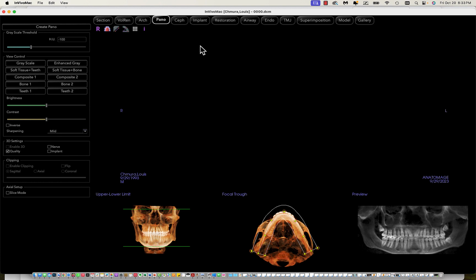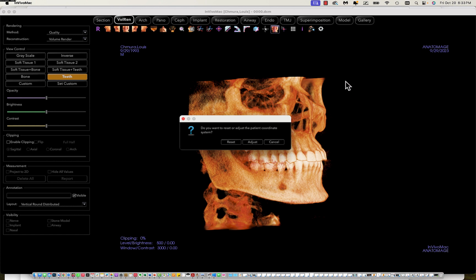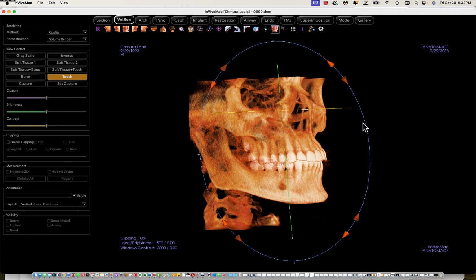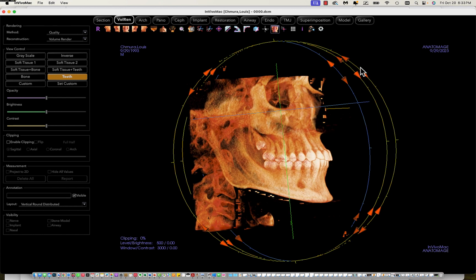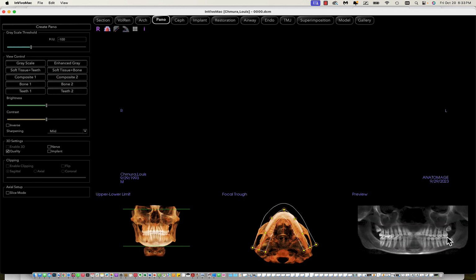okay? And if I go in and do it again, tip it way up, you get a reverse smile arc, okay?